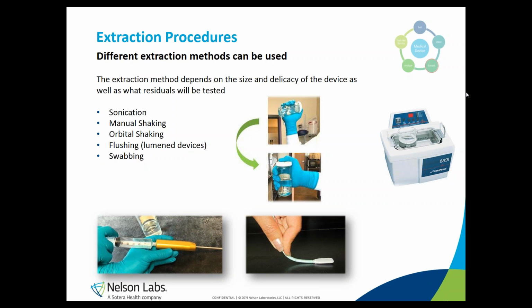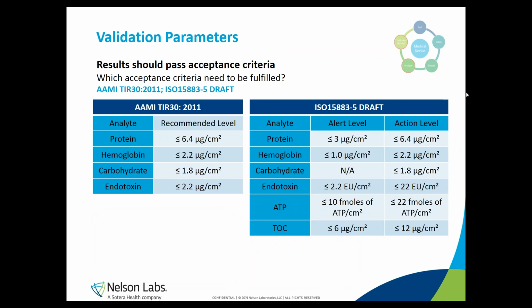And Stefanie, how clean is clean? Well, that's a very nice question, Melissa. After extracts from the medical devices are collected, we will determine how clean they are, and therefore we use the acceptance criteria that you can find in some of the guidelines here on the slide.